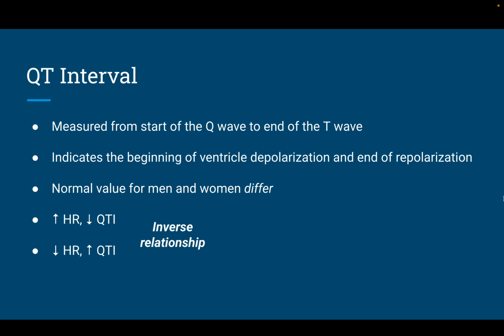There's an equation that is out there that you can use to get your corrected QT interval. However, the LIFEPAK denotes a QTc, which does all the math for you, and it's very accurate, so you can just use that. Cardiologists and electrophysiologists in the hospital might redo it, especially if they're doing diagnostic testing. However, for us, we can use that QTc that is on the 12-lead printouts.